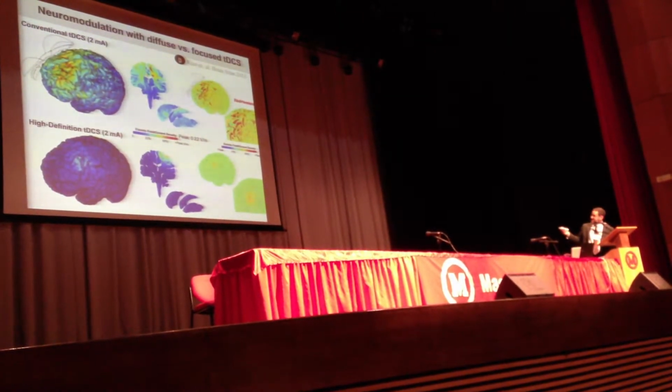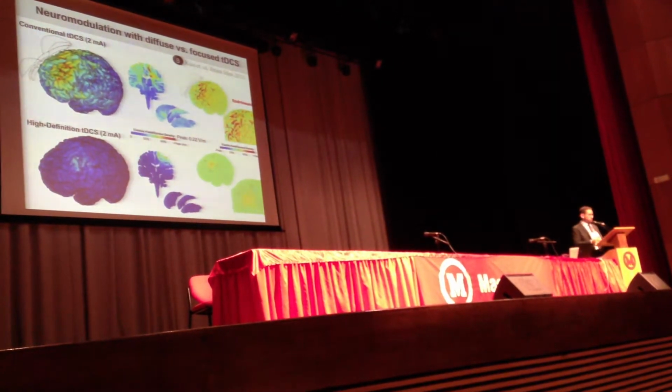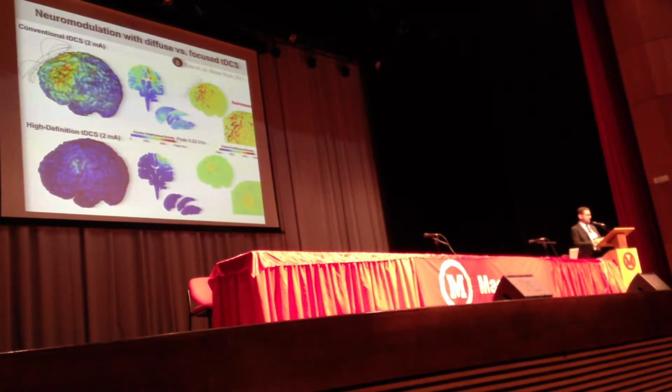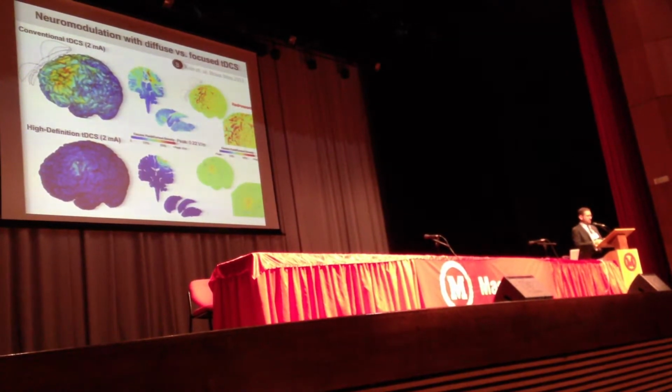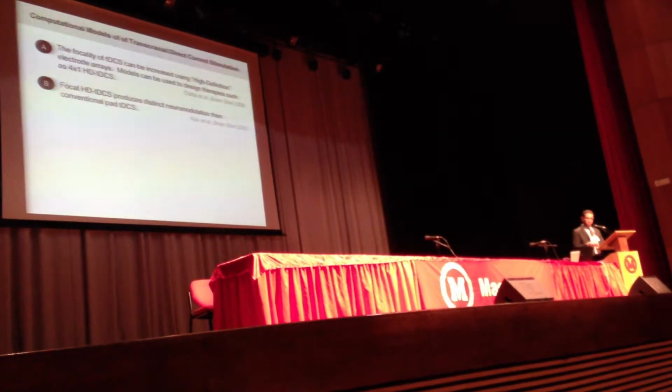And now again, you can see that yes, the conventional montage produces much more diffuse current flow. But if you focus just on the motor region, and maybe even just on the hand knob, that difference now is not as dramatic. And so it's an important point.